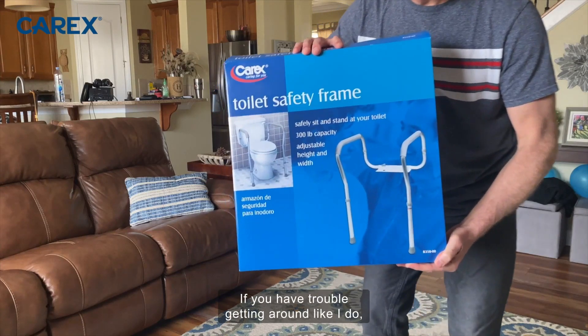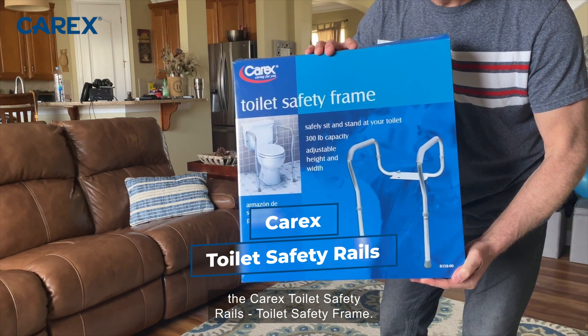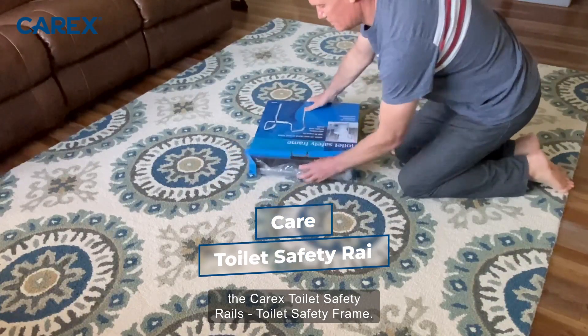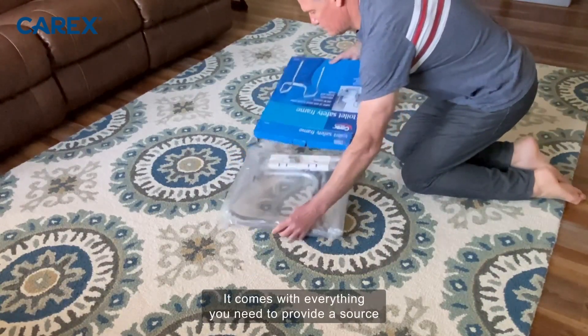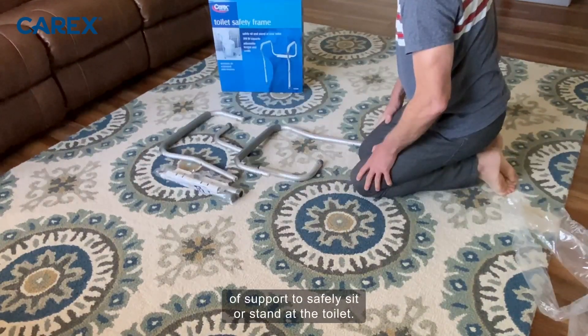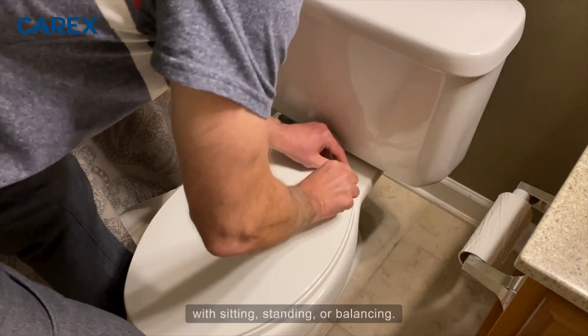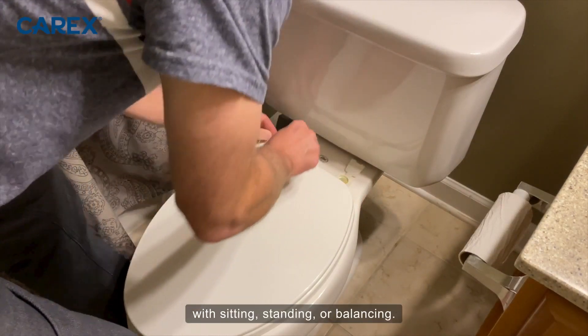If you have trouble getting around like I do, you need to check out the Carex Toilet Safety Rails Toilet Safety Frame. It comes with everything you need to provide a source of support to safely sit or stand at the toilet. It's for anyone who struggles with sitting, standing, or balancing.